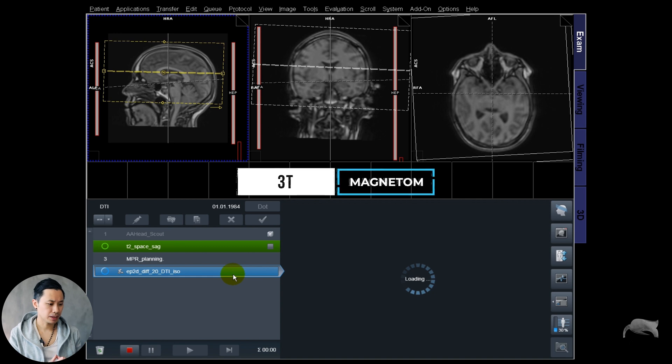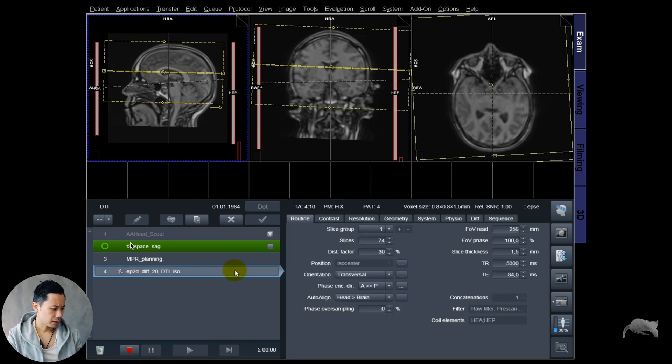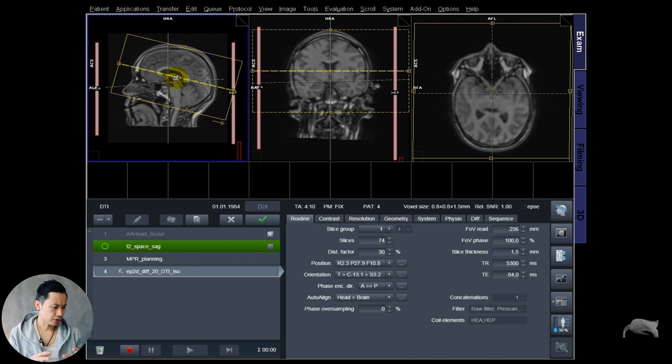We are currently at 3T but this works on 1.5 as well. I already ran a T2 SPACE 3D sequence here and I have a preparation for the brain. Now we have a DTI right there.